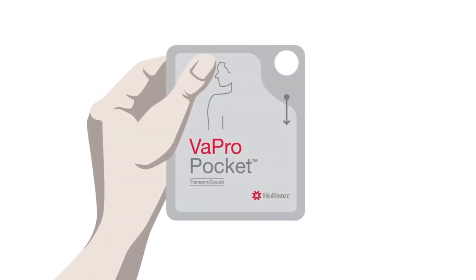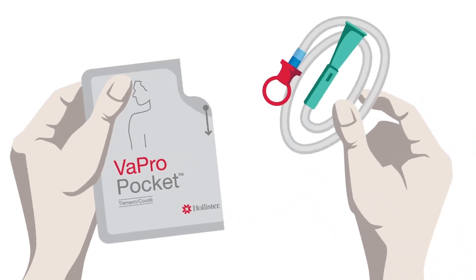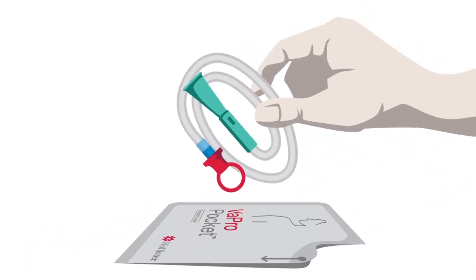After you have washed your hands, you can open the Vapro Pocket Cudé catheter package. This can be done by inserting your thumb in the finger hole or placing your fingers at the top of the strip and tearing down the side of the package. Now that the package is open, you can remove the catheter and place it on the open pack, which is left on a flat surface.